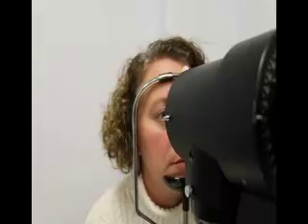The next step is to align your patient. With the chin resting in the chin rest, turn the chin rest elevation knob up or down so the center of the patient's forehead is resting against the forehead bar.